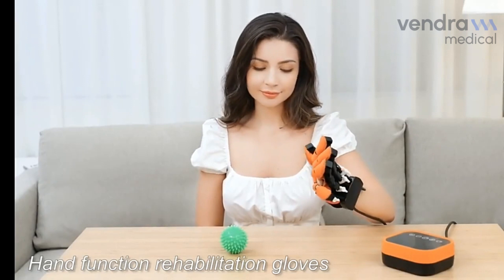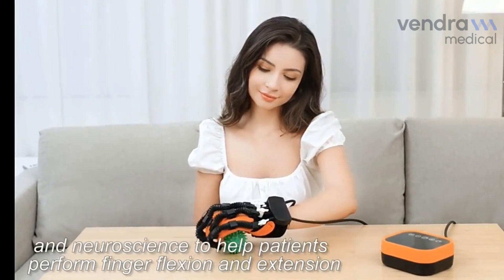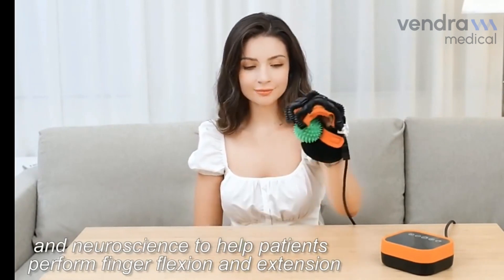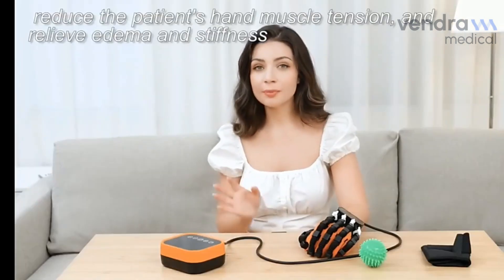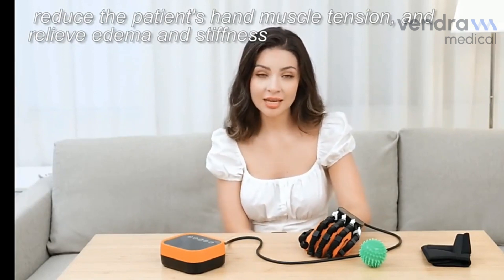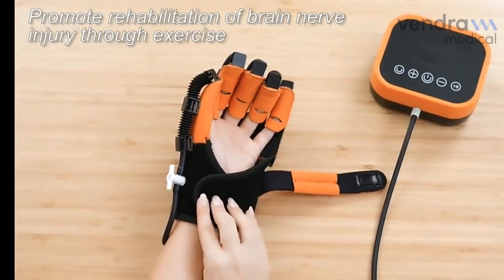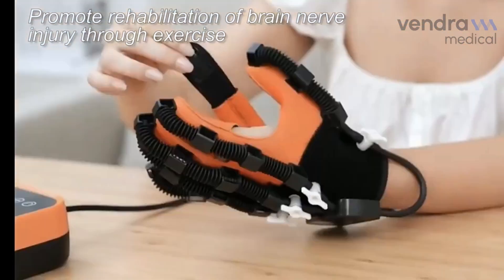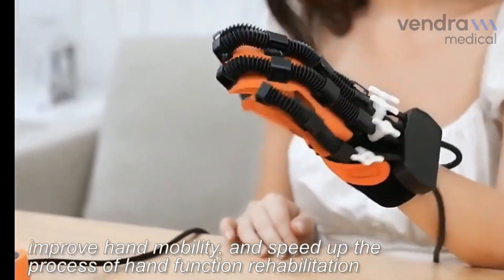Hand Function Rehabilitation Gloves combine flexible robotic technology and neuroscience to help patients perform finger flexion and extension. They reduce the patient's hand muscle tension, relieve edema and stiffness, promote rehabilitation of brain nerve injury through exercise, improve hand mobility, and speed up the process of hand function rehabilitation.